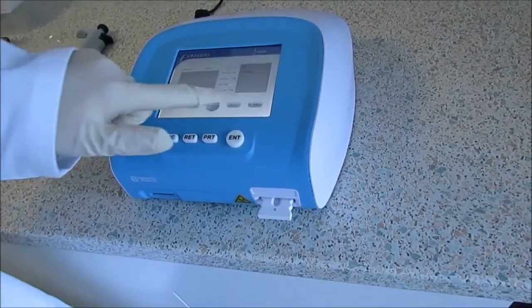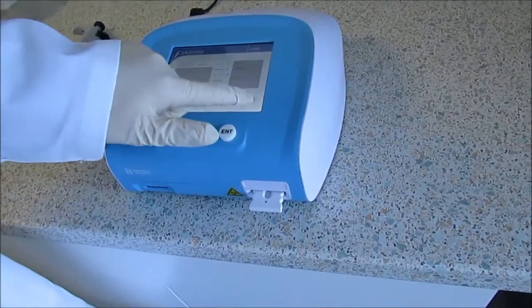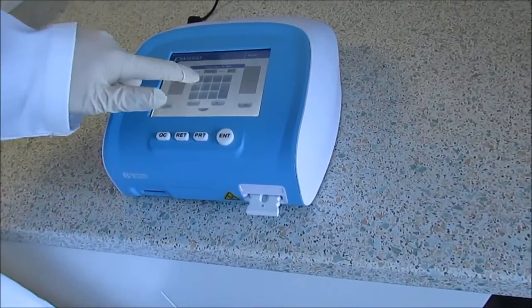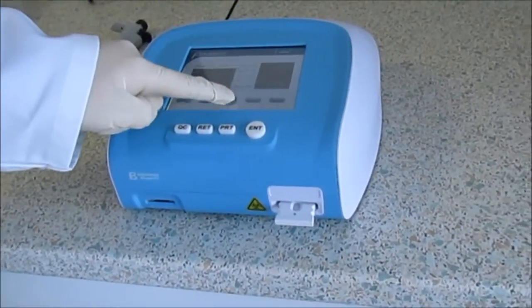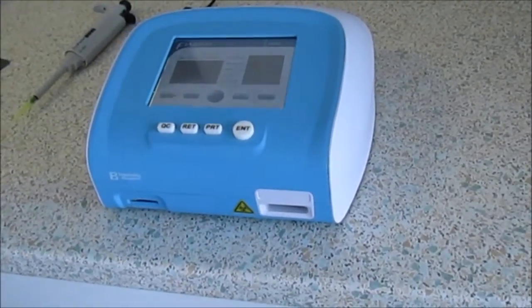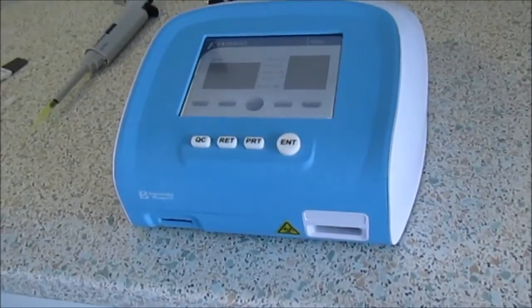Using the touch screen, select the specimen being tested such as whole blood, plasma, serum or urine. Insert the patient ID number and press measure to start the test. Results are automatically printed and stored in the device.